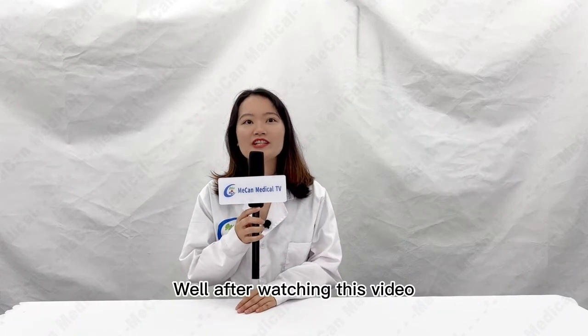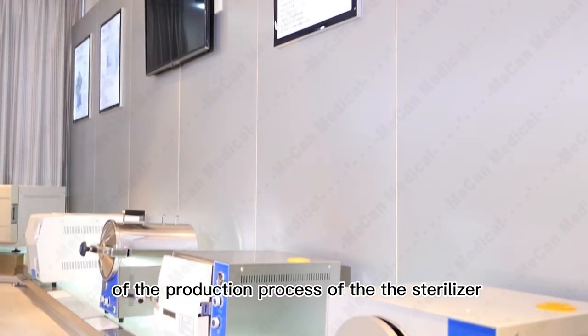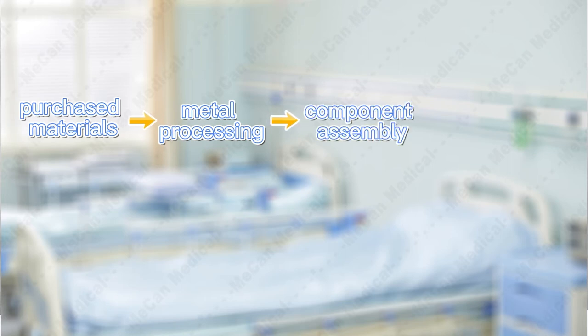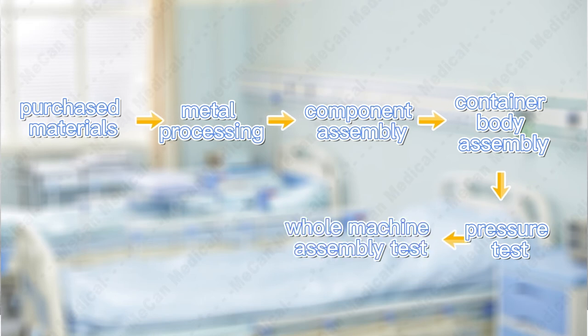After watching this video, you should have an understanding of the production process of the sterilizer. The whole process is divided into: purchasing materials, metal processing, component assembly, container body assembly, pressure test, whole machine assembly test, packaging, and finished product storage.